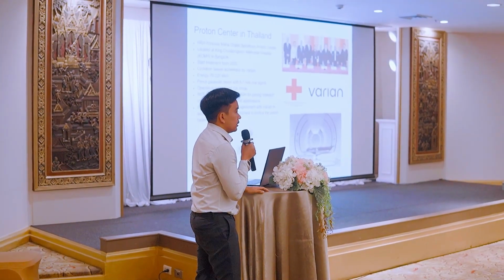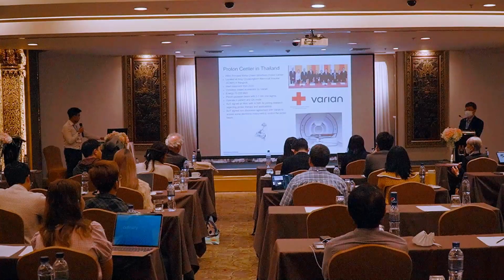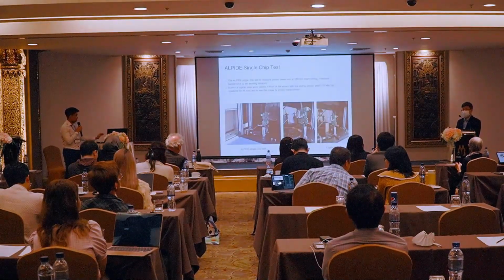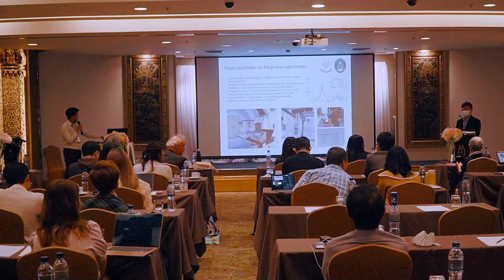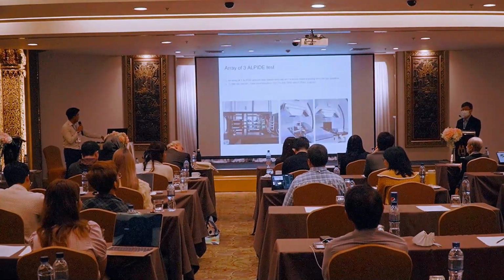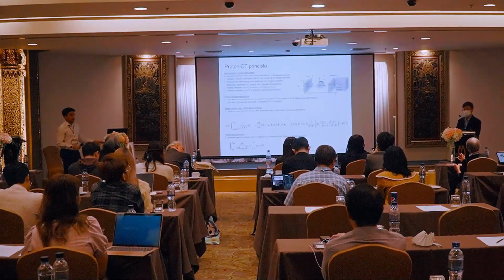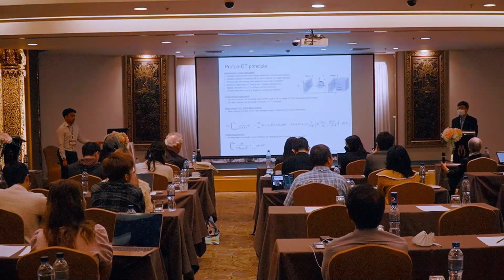But if you want to do it for the real organ, the range of 250 MeV protons is only 38 centimeters. Then it will stop inside the phantom, actually. So we can't do proton tomography with this energy. Do we have any plan or suggestion on this? Otherwise the proton will stop already, and we can't detect any proton transmitted to the detector.